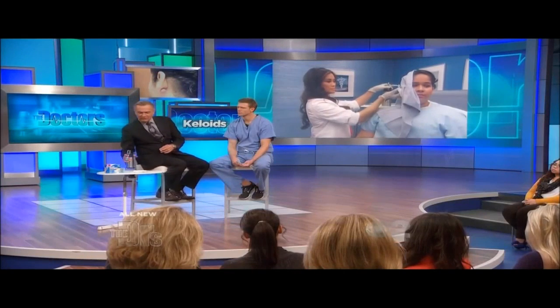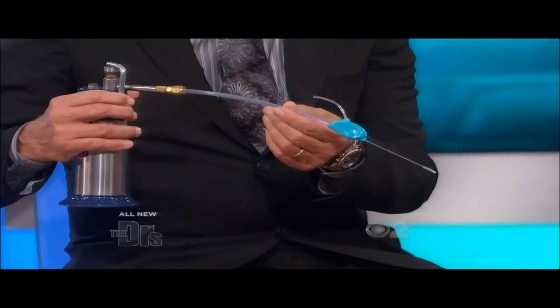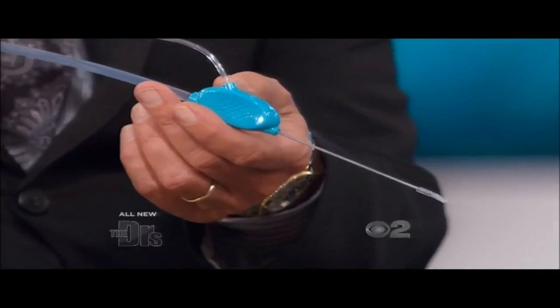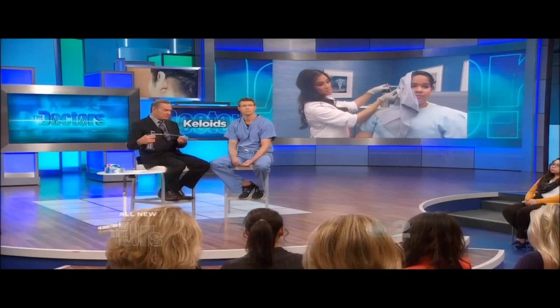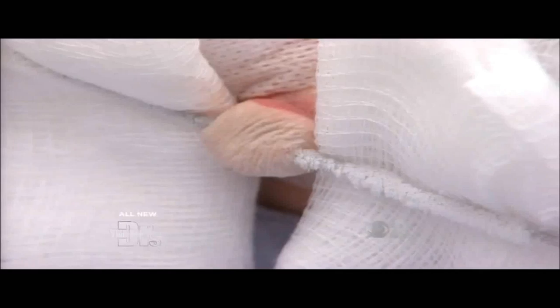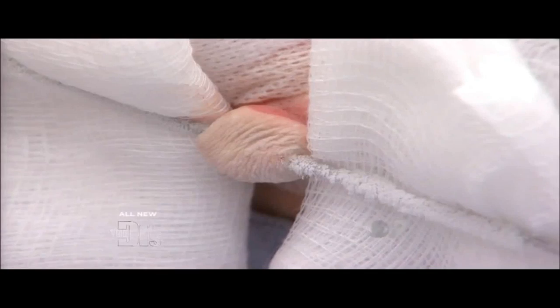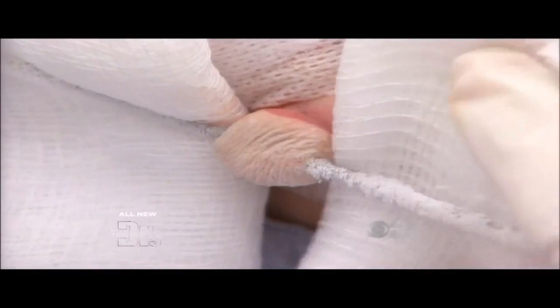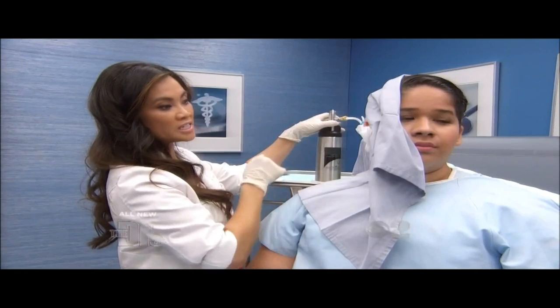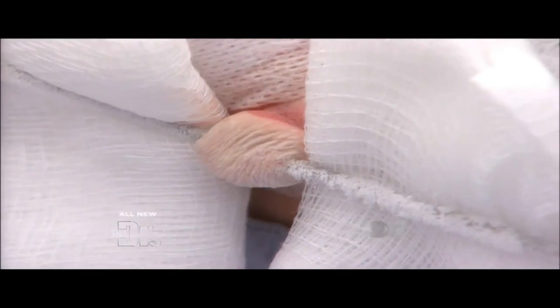And then finally, Dr. Lee was nice enough to give us another one of the same device, but you'll see the probe here is going to freeze up. You see, it's almost there. As you can see, it's frostbite. This is a probe where it shoots the liquid nitrogen right into this little probe, and we insert it into the center, and you can see it induces frostbite. Anything that comes into contact with it. And that's why I use these sponges, these gauzes, to kind of protect the normal skin. And we're almost there. Just the edge of it needs to freeze. And after this, it'll just thaw, and I can remove the probe, and she can go home.